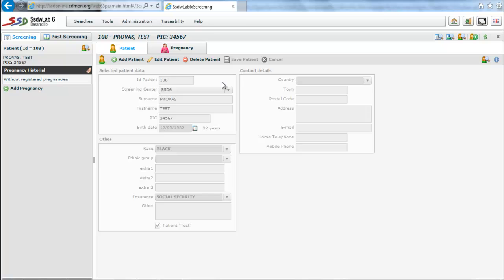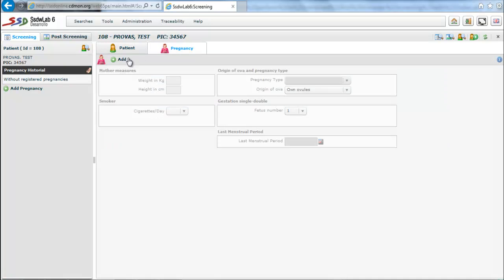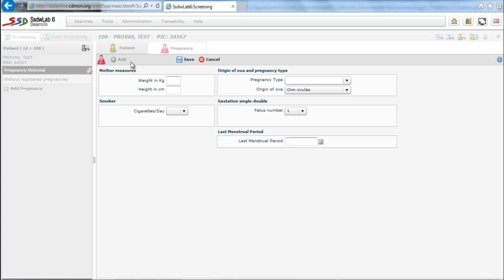In the right side of the screen we see a section about contact information of the patient. The following is the pregnancy folder. In this folder we collect information concerning the pregnancy.